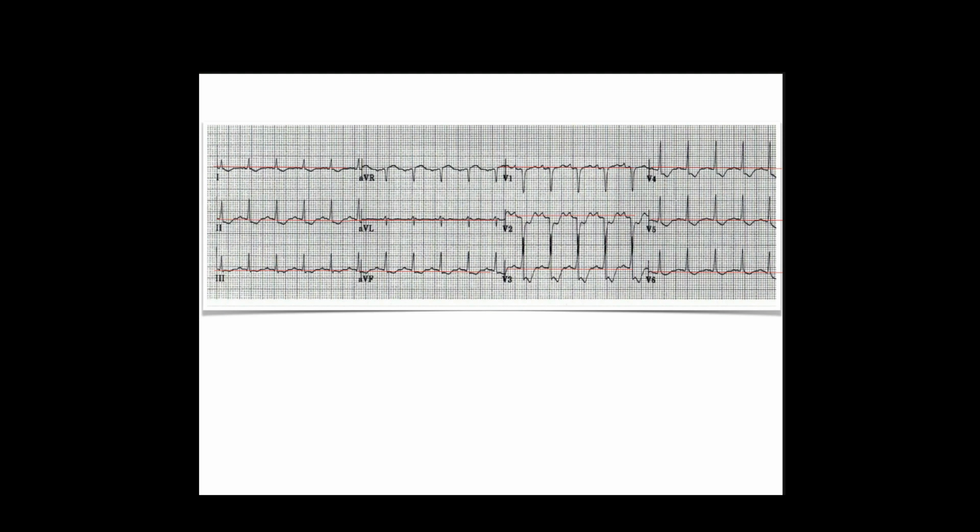Kyle, do you want to go through, please, and tell us where you see ST depression? They're not positioned right. See 1, 2, 3, and AVF. Kind of hard to see in AVL. V2, V3, V4, V5, maybe a little V6. Everywhere. So again, is this widespread diffuse ST depression? Yes, it is, of course.